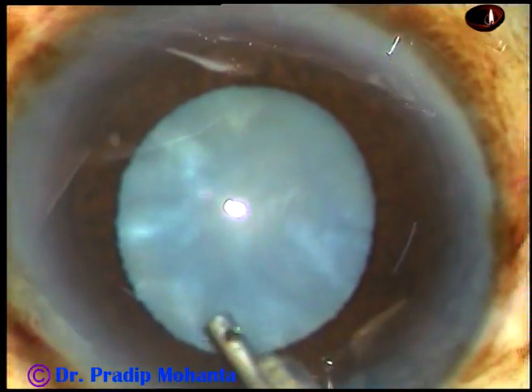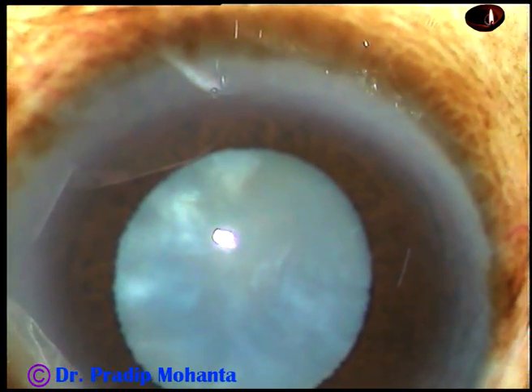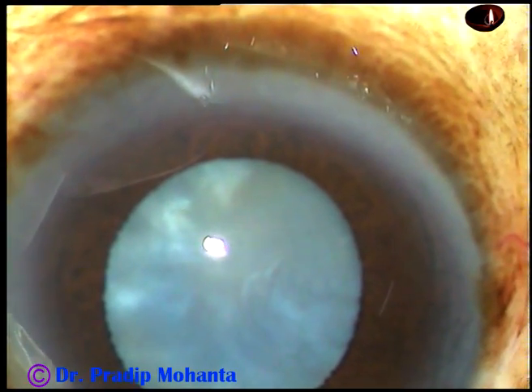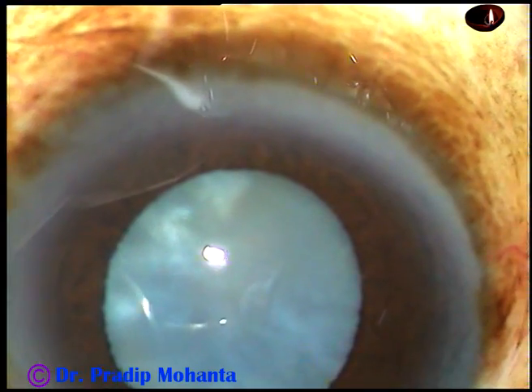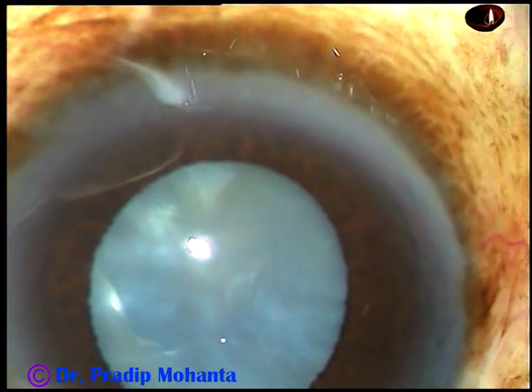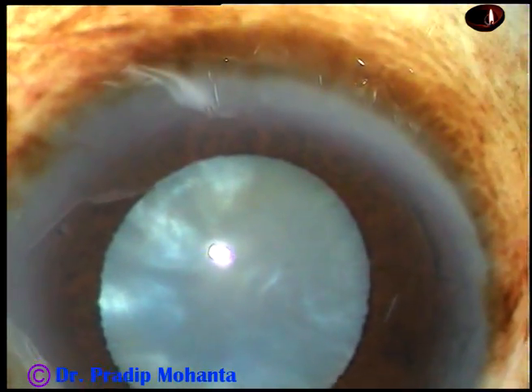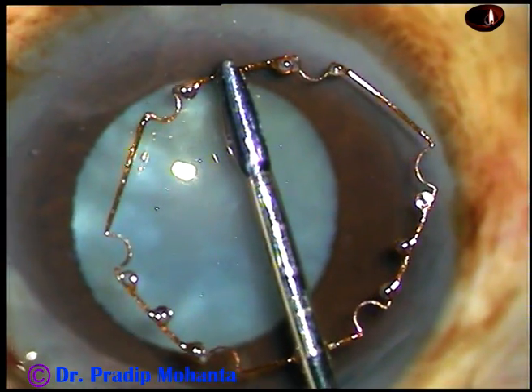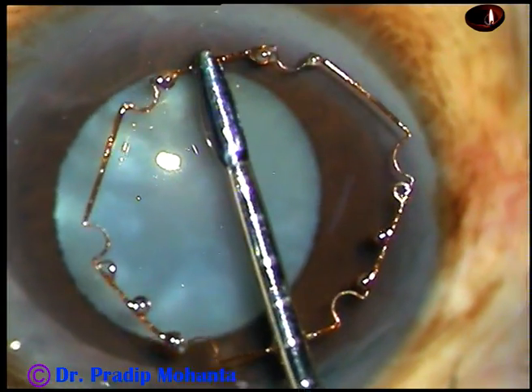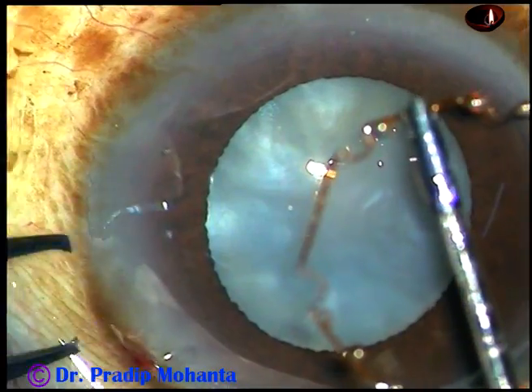We can see that the pupil has not dilated well. In this case, the size of the pupil is about 4.5 millimeters, and I would like to use some pupil expansion device to dilate it a little more. And this is B-hex, a pupil expander invented by Dr. Suvin Bhattacharji of India.